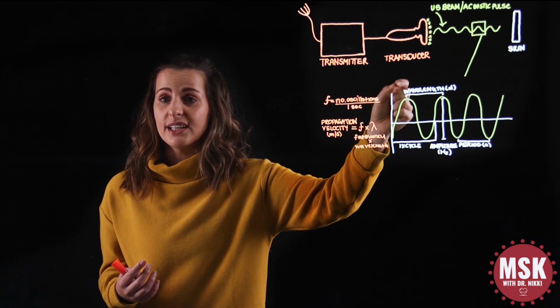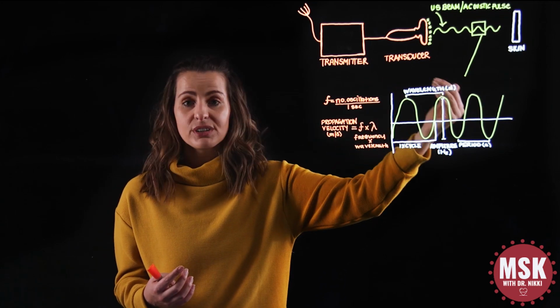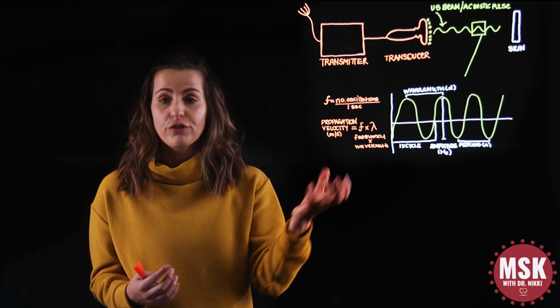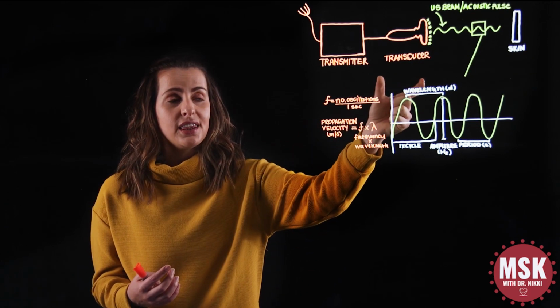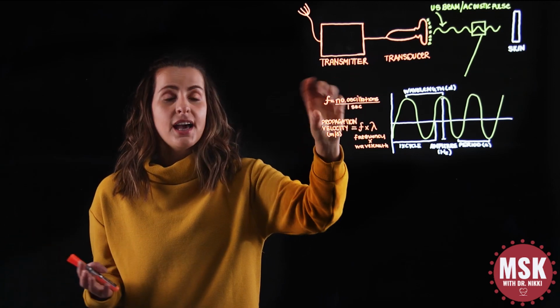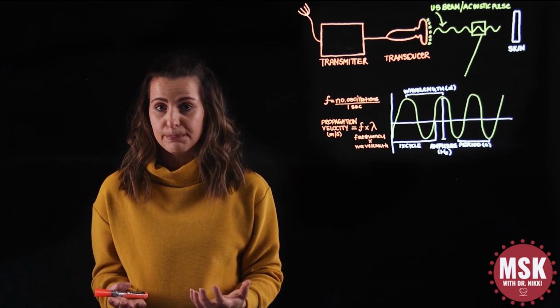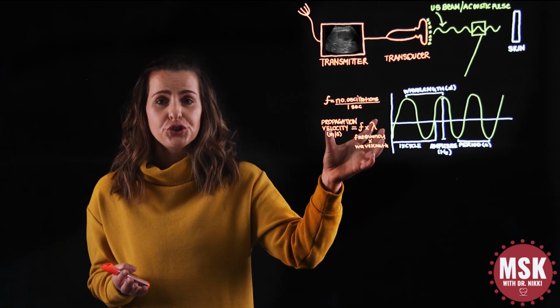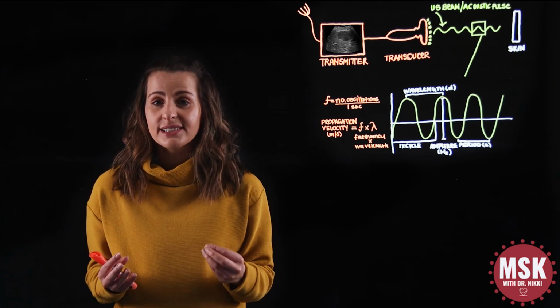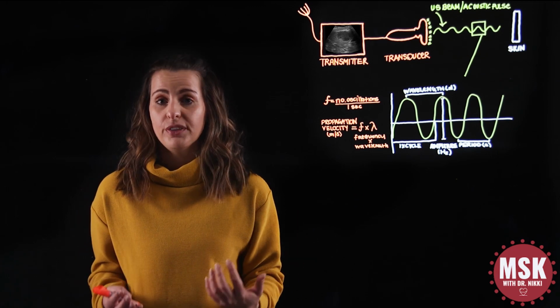Keep in mind in this process, the piezoelectric crystals are also important on the way back, because as they receive the incoming beam or wave, they are going to vibrate, deform, and convert this back into energy. The energy then gets transmitted to the ultrasound machine or your iPhone or your iPad, and that ultimately will interpret the incoming information and create that picture. Ultimately, the transducer is going to spend most of the time just listening for the echoes that are returned from those internal tissues of the body.